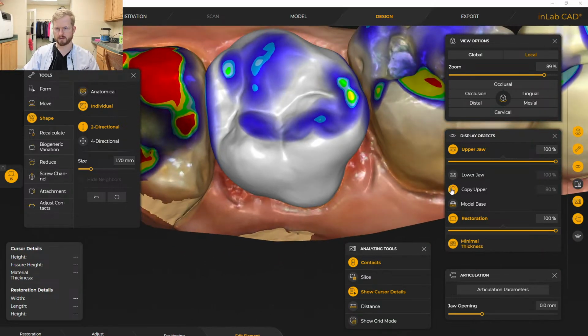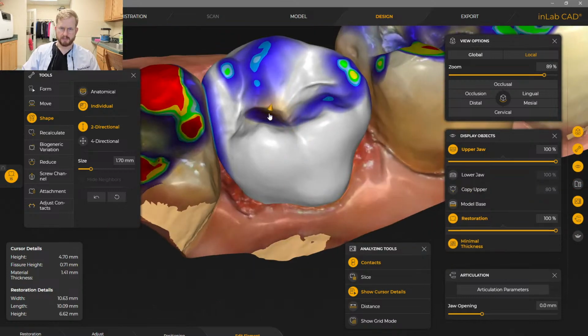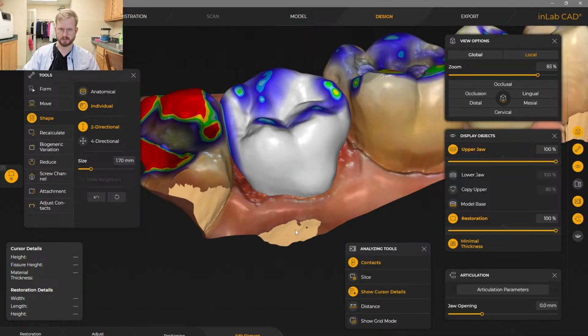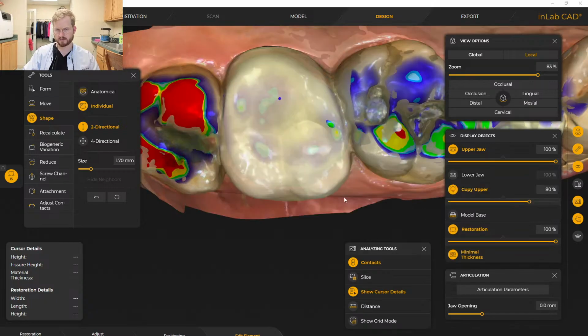Okay. Do we want to give occlusion anywhere else? Maybe here would be nice. This a little more bold would be cool. Transverse ridge, a little more action there. All right.